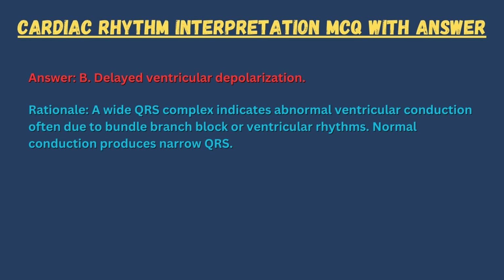Answer: B. Delayed ventricular depolarization. Rationale: a wide QRS complex indicates abnormal ventricular conduction, often due to bundle branch block or ventricular rhythms. Normal conduction produces a narrow QRS.